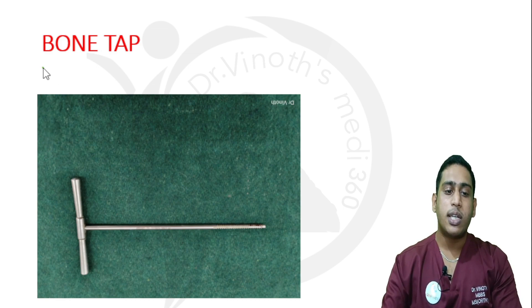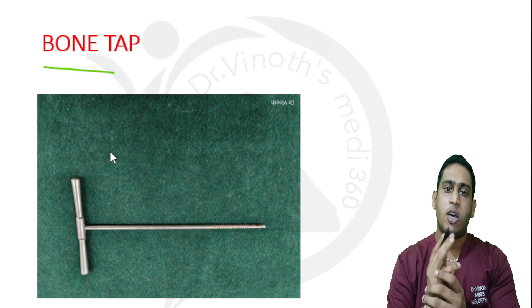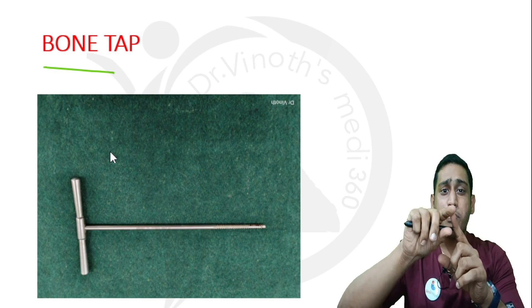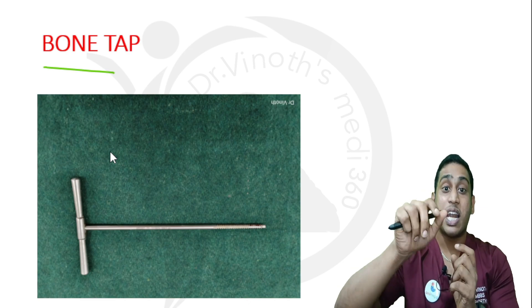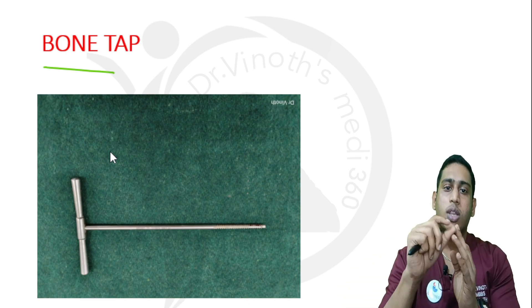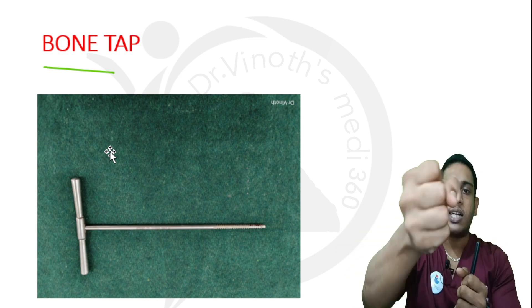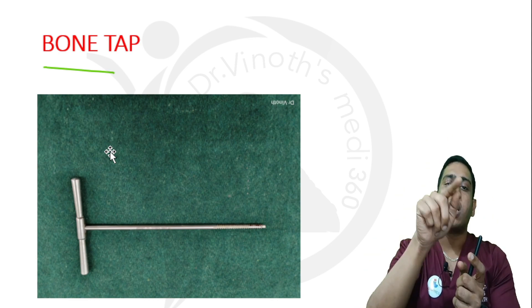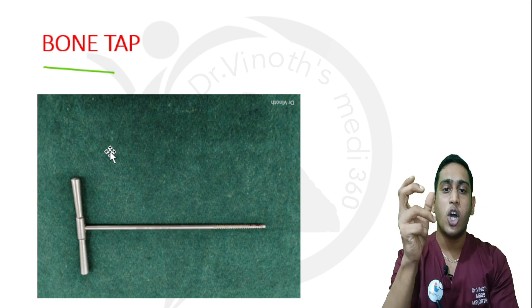This one is called a bone tap. If I need to apply a screw to the bone surface, after drilling with a drill bit, the drilled area may not match the thread of the screw — because older screws are not self-tapping. So I use this T-shaped instrument to tap the hole, so that the thread of the screw matches the thread on the interior bone surface, allowing the screw to penetrate easily and hold firmly.